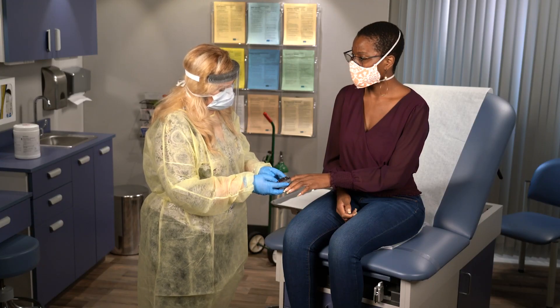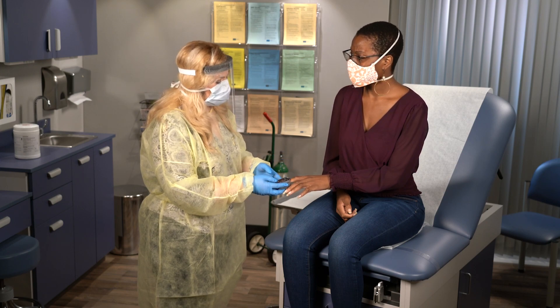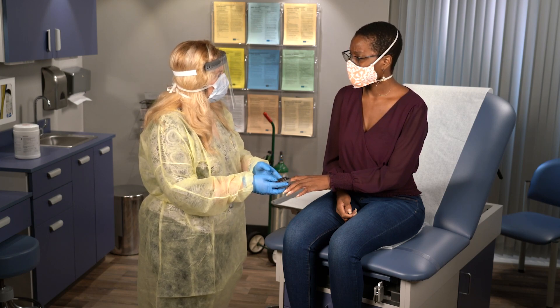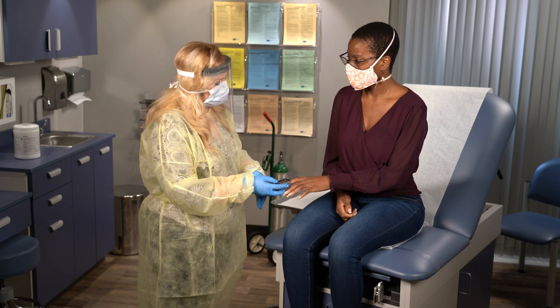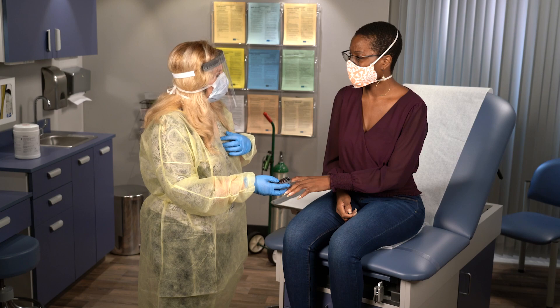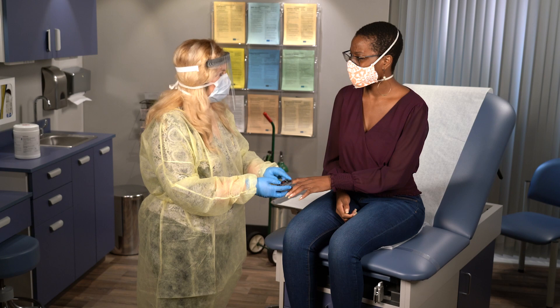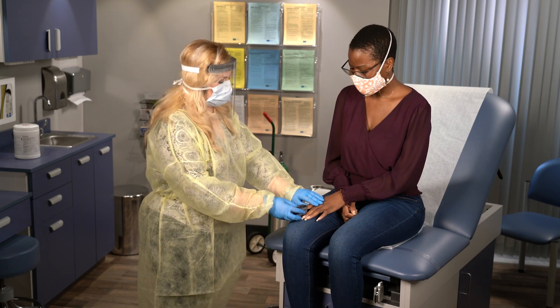Your oxygen levels are low. So what does that mean? Some people with COVID-19, even if they don't have trouble breathing, can have low oxygen levels. I recommend we start oxygen therapy so that your brain and your heart can get the oxygen that you need. Okay, if you think it'll help. But does it hurt? Oh no, it's not going to hurt at all. You can just rest your hand right there.